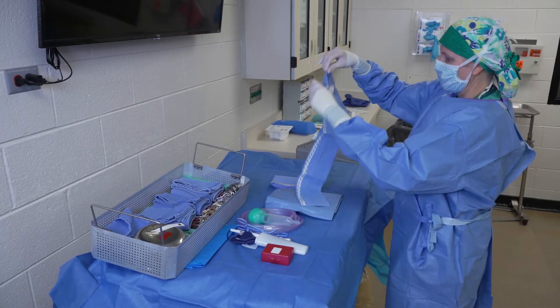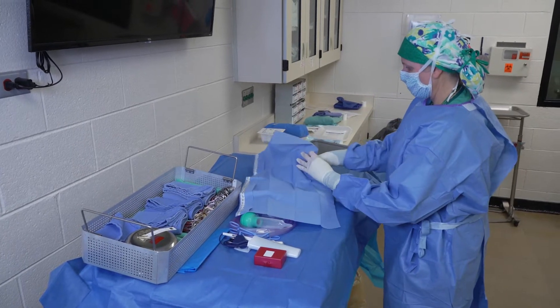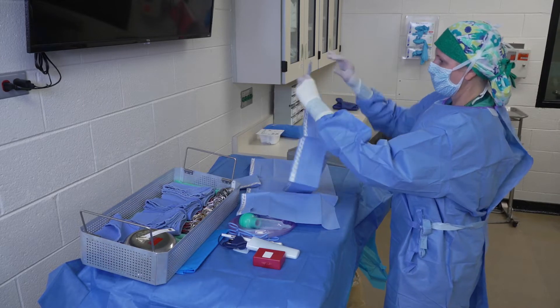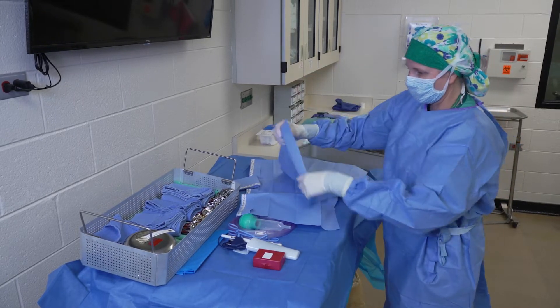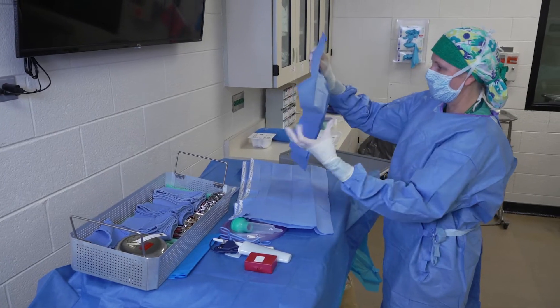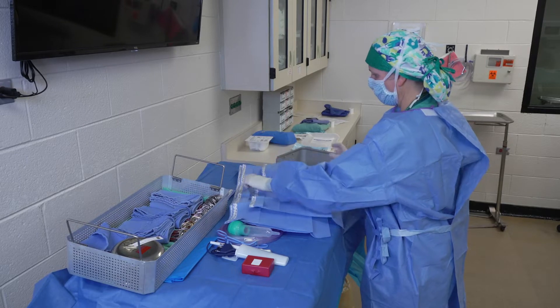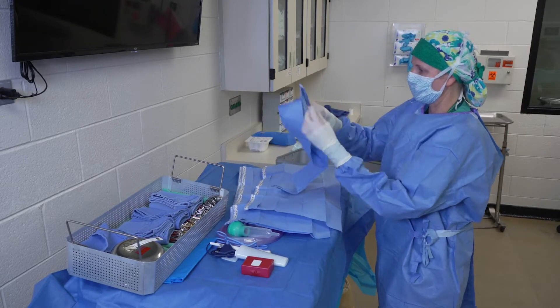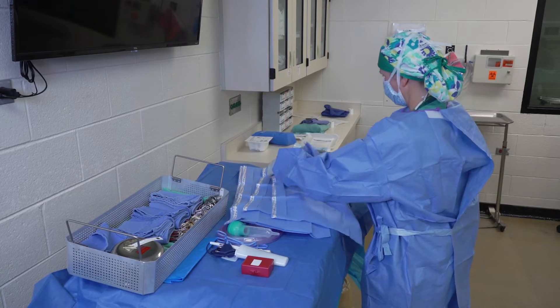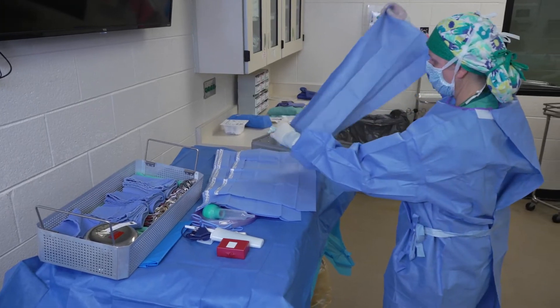I'm going to open up my drapes and lay them out with the sticky side up so I'm all prepared for draping. These drapes come with an edge that's already pre-folded over, and that's going to be the edge that contacts my patient. This prevents me from contaminating them as I open them up here on top of my drapes.